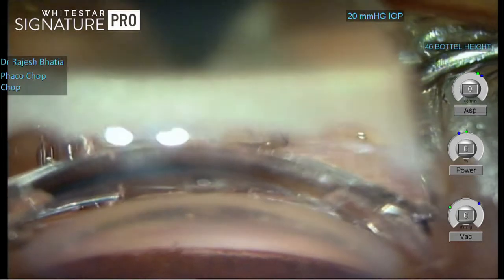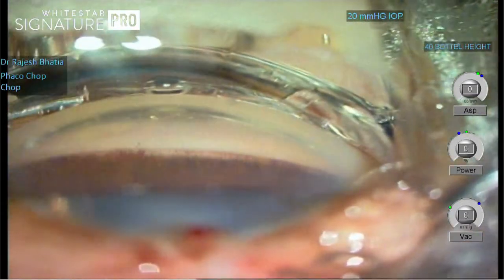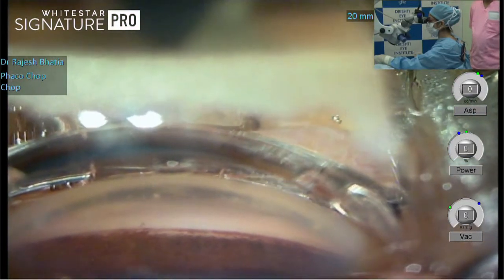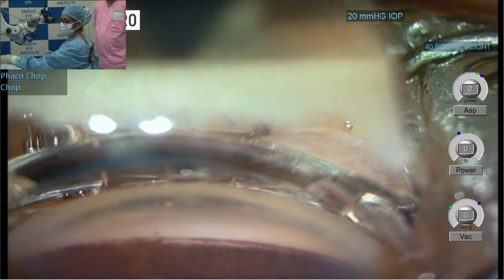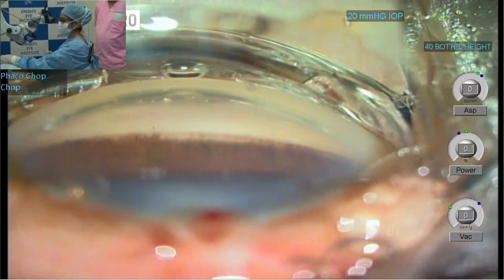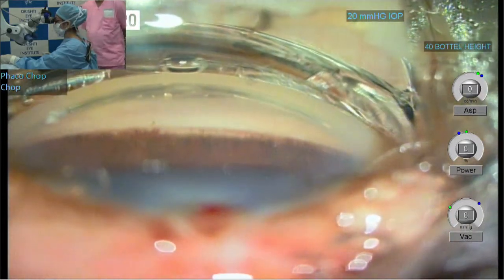So you can visualize right now, if I can center it a little more, the red line that you see over there is the trabecular meshwork. Please center it, Shaiwan. Okay, it is not focused, Shaiwan. Is this better? Yeah, better. Okay. This is a little off focus for me.